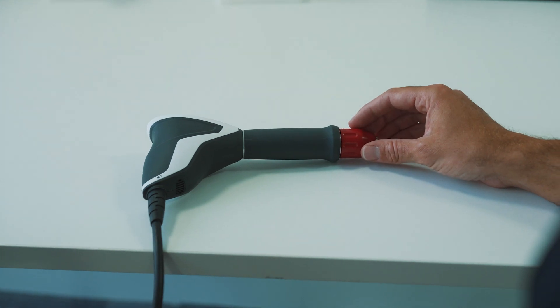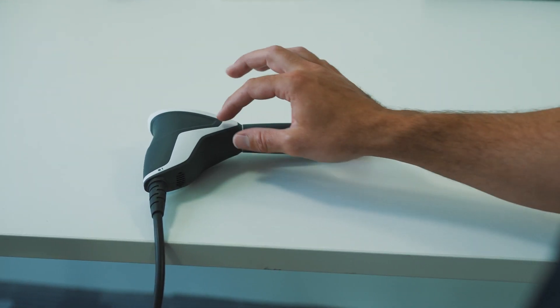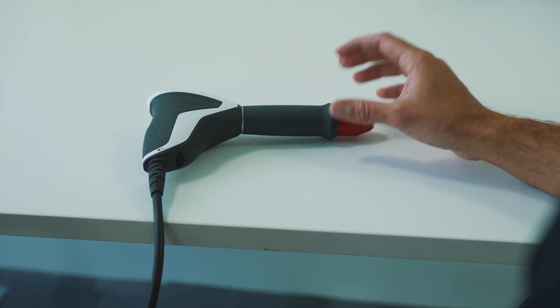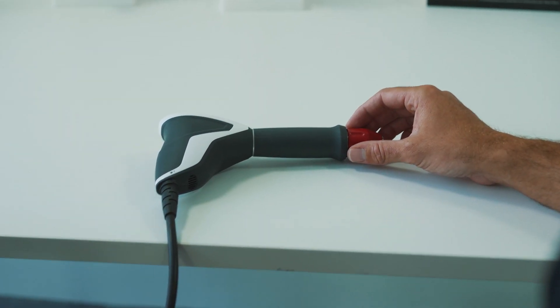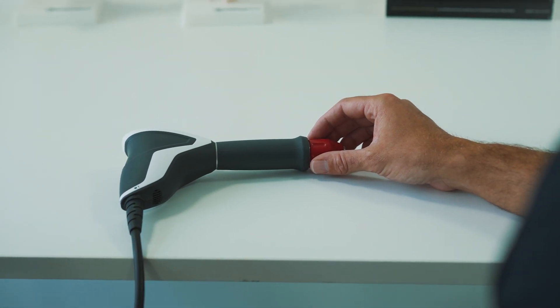The second part of the cleaning process is to ensure that the handpiece itself and the barrel is cleaned. We suggest that you do this as a minimum of once a week. Again, make sure that the device is switched off and the handpiece disconnected.